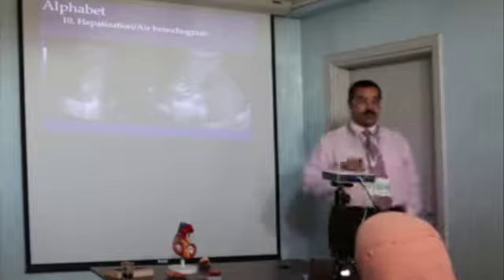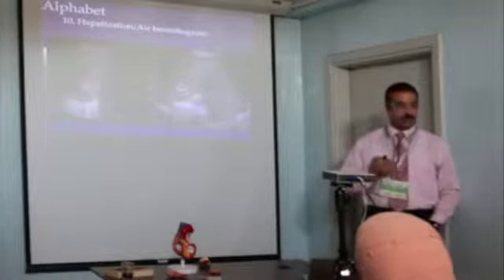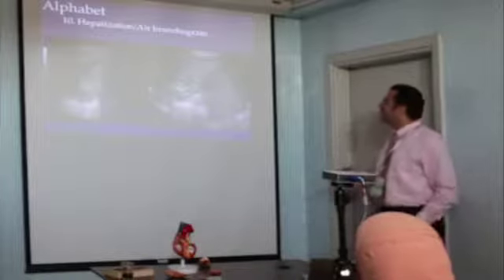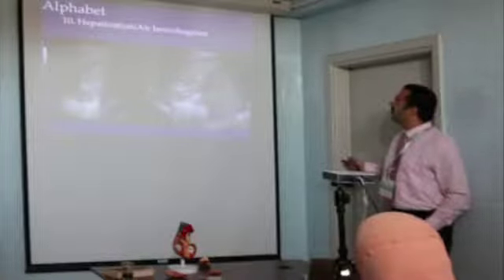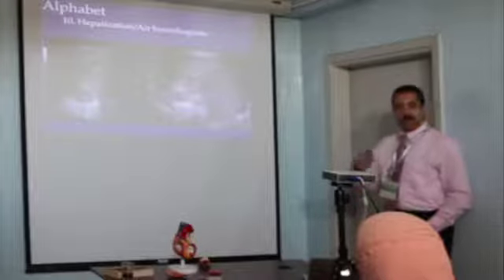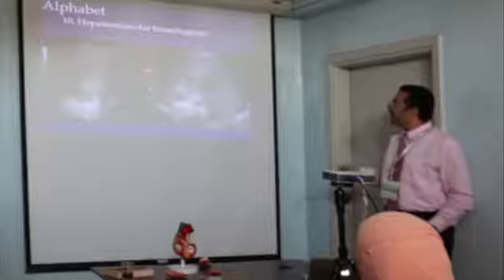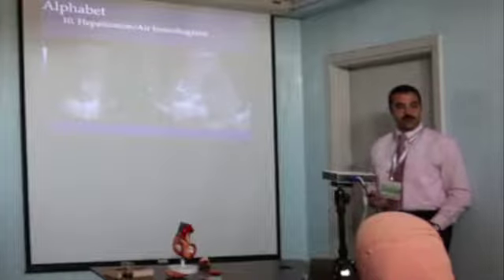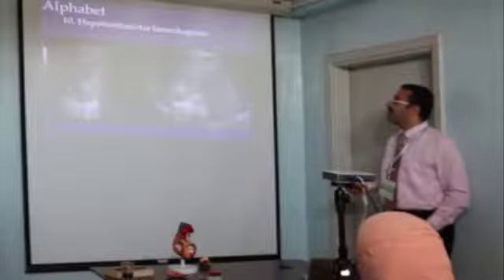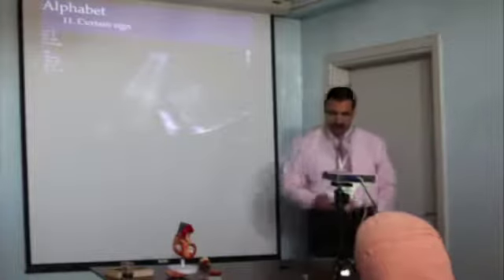Hepatization, consolidation, dynamic air bronchogram, another term used for pneumonia. See, this is the lung tissue, almost the same as the liver, and this is the diaphragm in between. If you see these threads and they are dynamic, that means there is active pneumonia. If it's a static air bronchogram, it may be atelectasis. It's one of the main differences. So this one I can say atelectasis, this one I may say pneumonia, but take it cautiously.